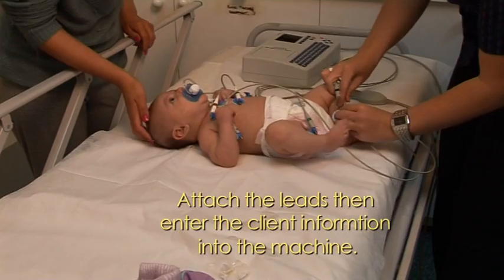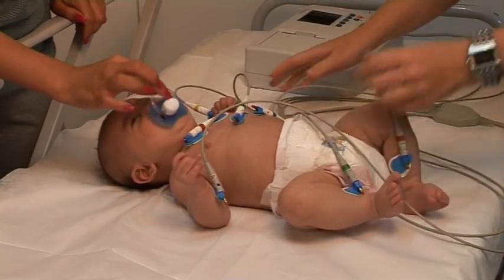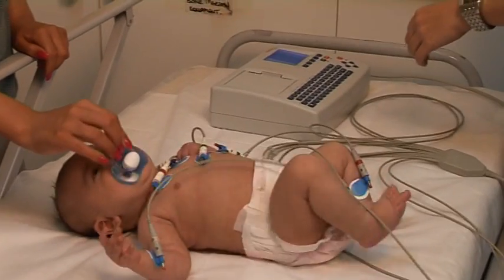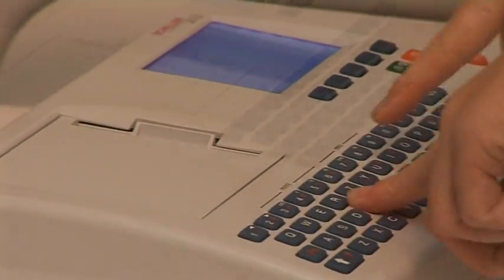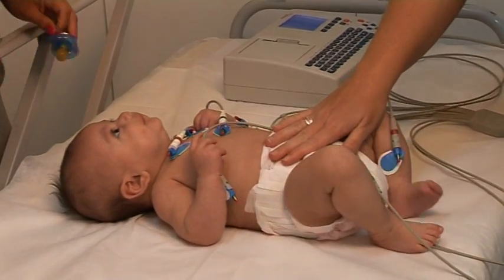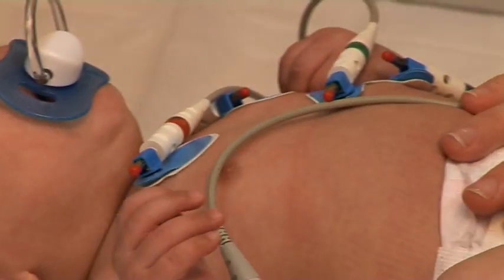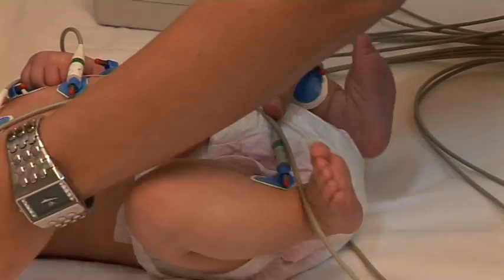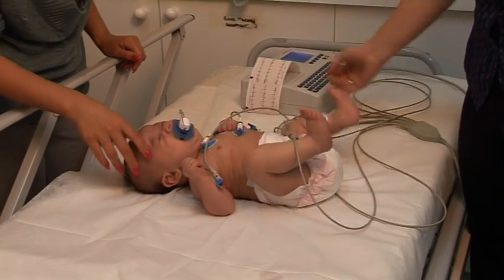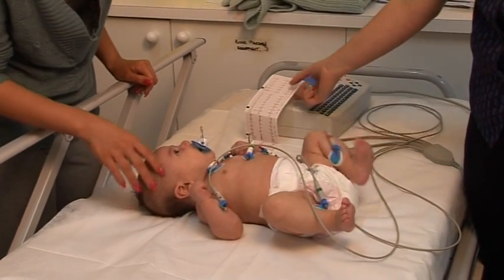It's not that bad. That's actually a pretty good one.